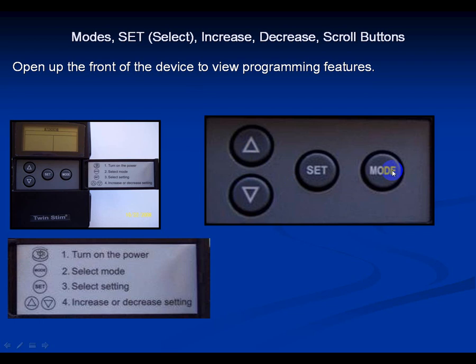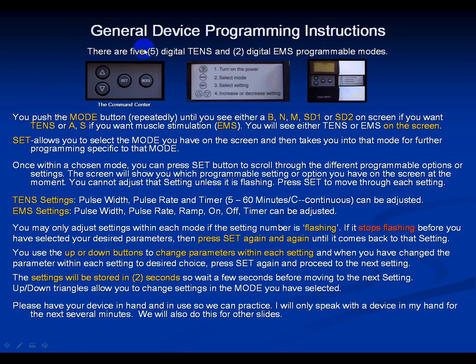Turn the device on with your electrodes attached to your thigh. Turn both amplitude dials on but keep them at zero power. There are five digital TENS modes and two digital muscle stim modes. In this training module we'll cover the TENS modes: Burst, Normal, Modulation, Strength Duration 1, and Strength Duration 2. Push the mode button and you'll see B, N, M, SD1, SD2 cycle through on screen.